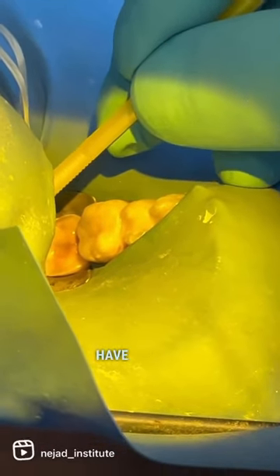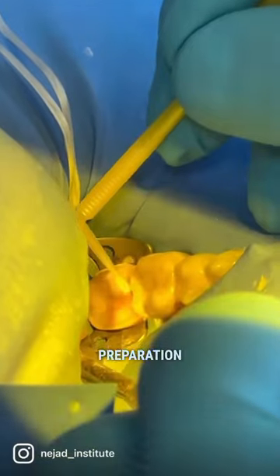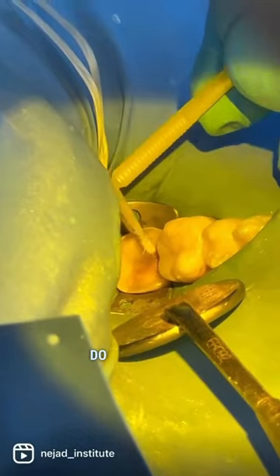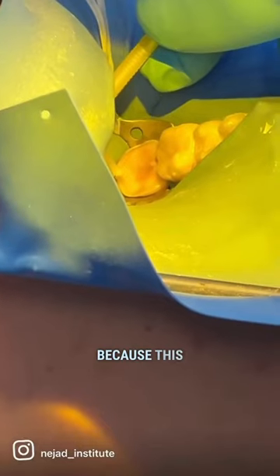During this step, my goal is to have a nicely rounded preparation, minimize sharp internal angles, and smoothen my preparation design. I am not trying to do anything to increase retention, but I am trying to do things that will make the ceramic have a uniform thickness, because this will help the fracture resistance and give me the best results.